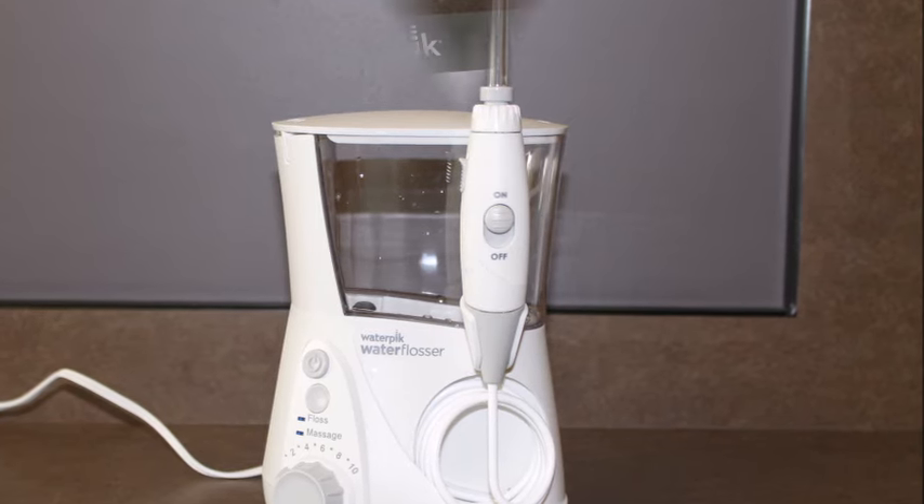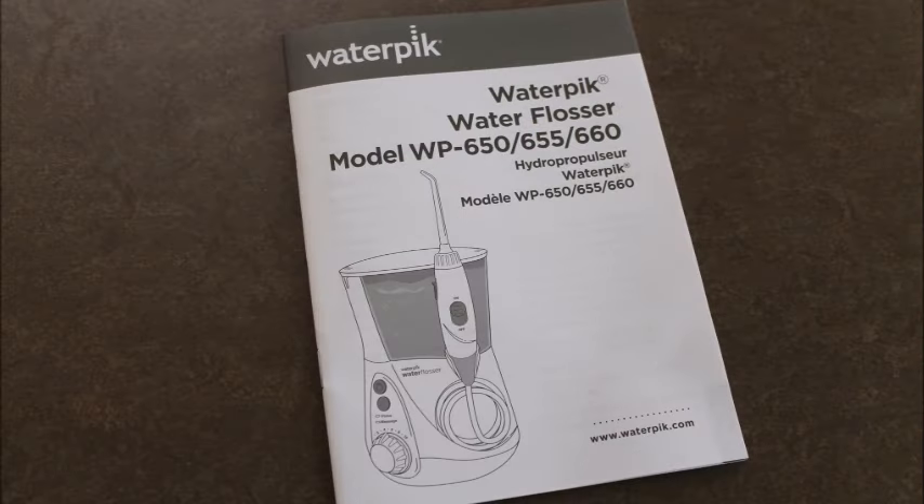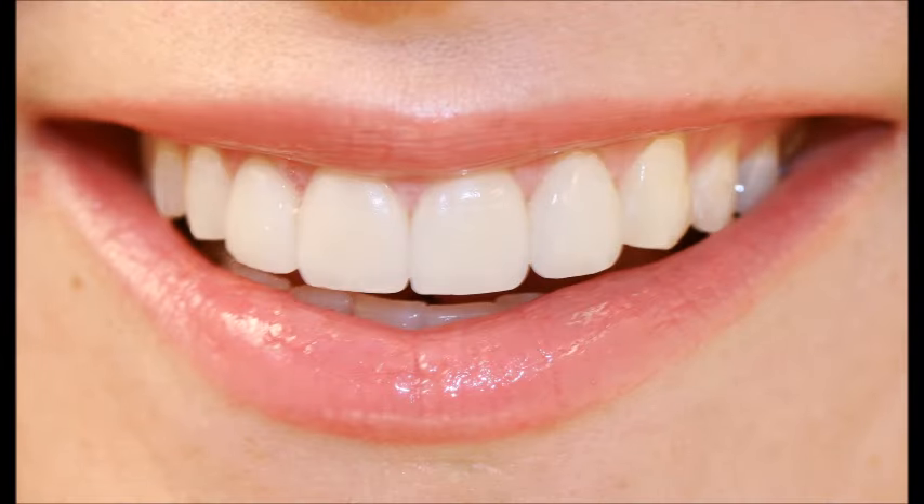Please use this video as your instruction guide and not the written instruction guide that comes with your machine. One of the underlying factors in your gum tissue health is the presence of bacterial plaque in areas that are hard to reach with brushing or flossing alone. Let's look a little closer at this so you can better understand the why of using a water pick.